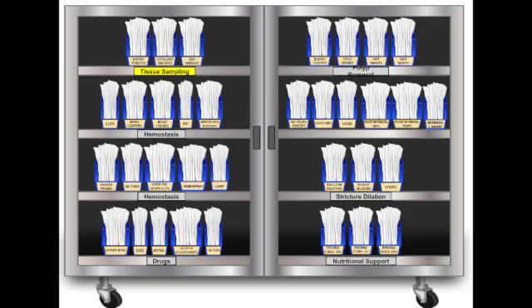Okay, makes sense. And speaking of biopsies, let's get into biopsy forceps. The obvious use is, well, taking a biopsy when you see something suspicious, maybe cancer, inflammation, infection. That's the primary use, yes. But the source material highlights something I found surprising, using them when the area looks totally normal. Yes, and this is a critical point for technicians to understand for preparation. Why biopsy normal-looking tissue? It seems counterintuitive. It does. But there are specific situations.